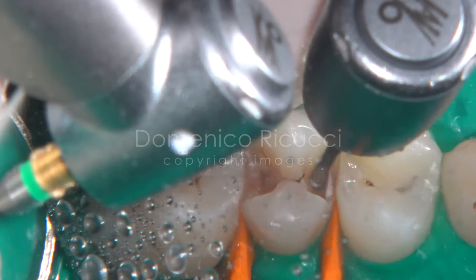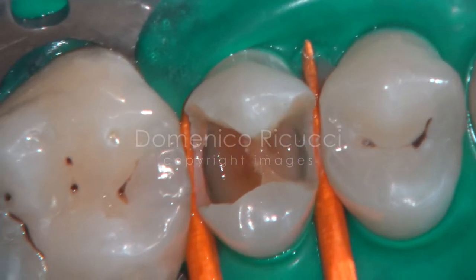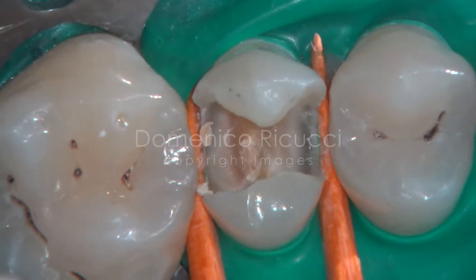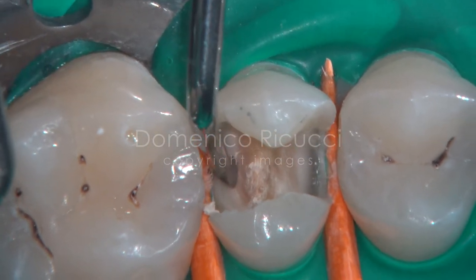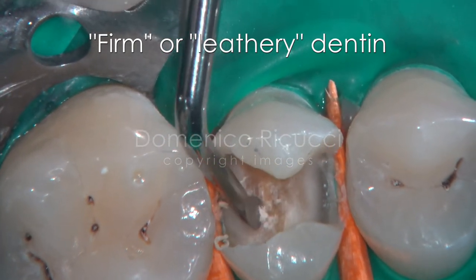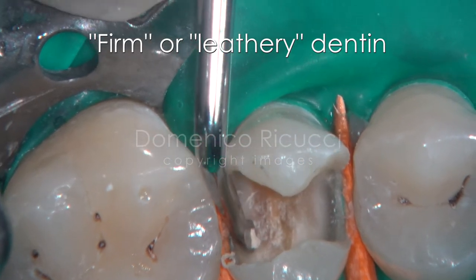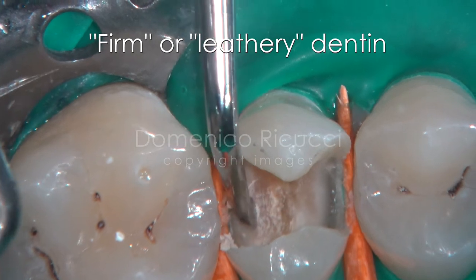Removal of carious tissue is initiated with low-speed long neck round burrs and a water spray. After removal of the large part of carious tissue, the deepest layers of softened dentin — usually referred to as firm or leathery dentin — are removed exclusively with sharp hand excavators.